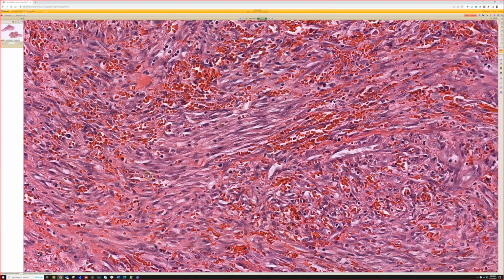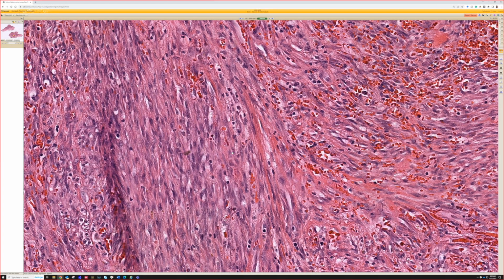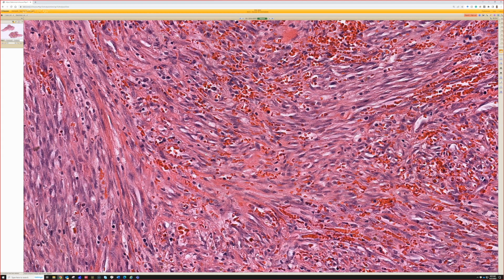But we've got the cells tend to be plump and they have mitoses, but they're not usually very pleomorphic. There are some exceptions, particularly in people with AIDS. There is a pleomorphic form of Kaposi. So if there's any doubt, do an HHV8, because even though you might think Kaposi sarcoma and angiosarcoma are both vascular and both called sarcoma, so they're pretty similar, right? Nothing could be further from the truth. They are a night and day difference as far as treatment and prognosis go.